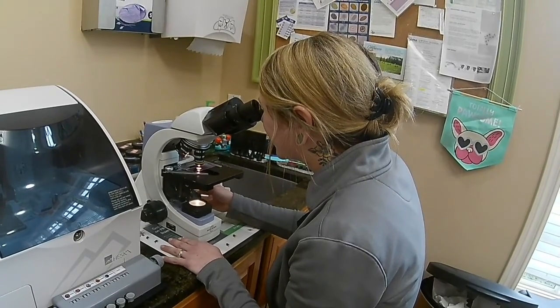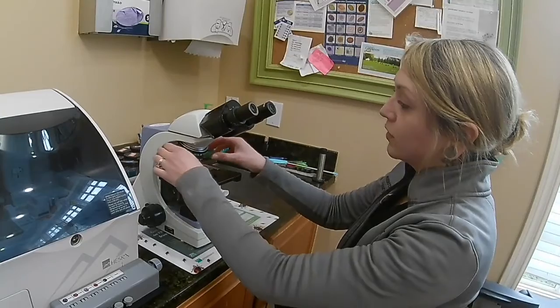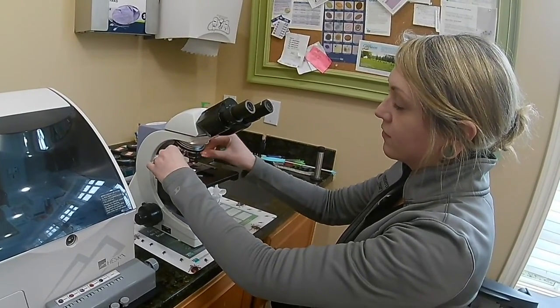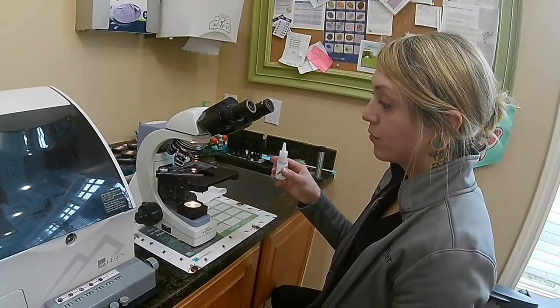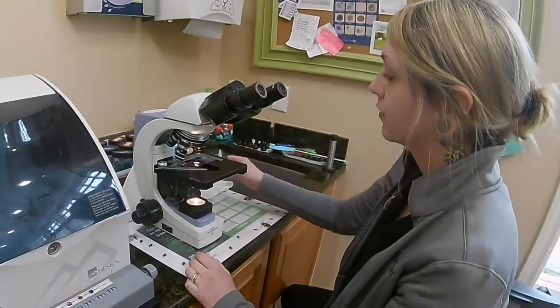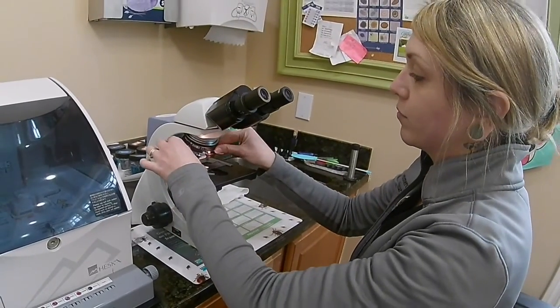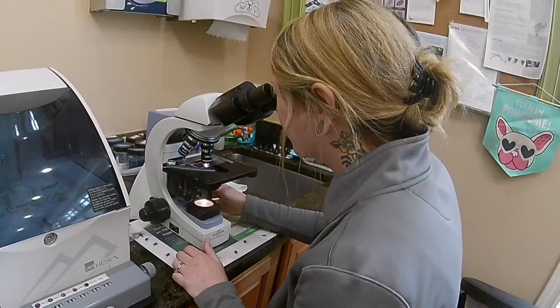Alright, we're looking good. So now what I'm going to do is switch my objective lenses into this somewhat halfway state. I'm going to take a drop of immersion oil and place that on my slide. And then I'm going to put my oil lens into place. Okay, and then we're going to refocus.